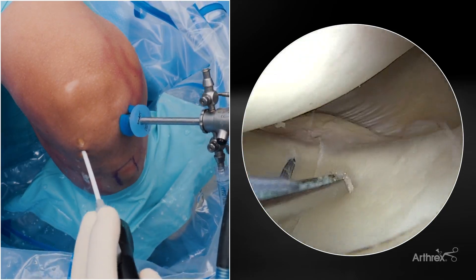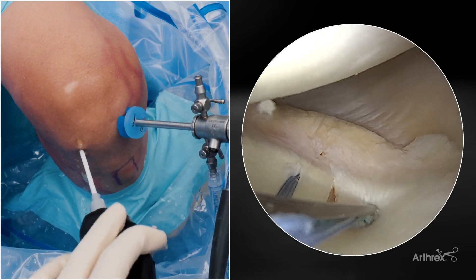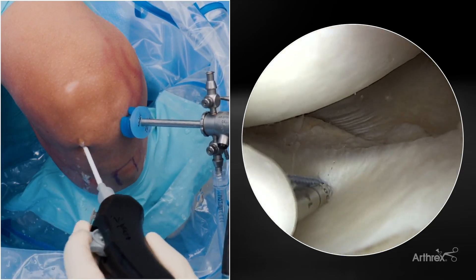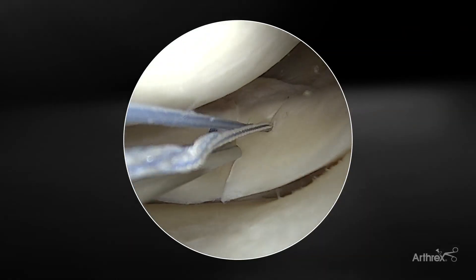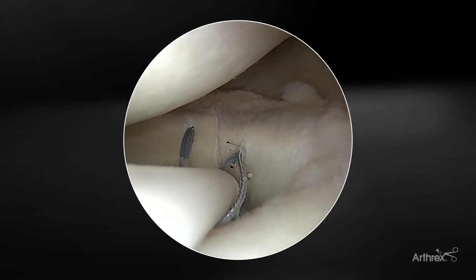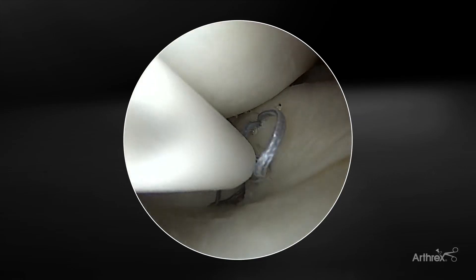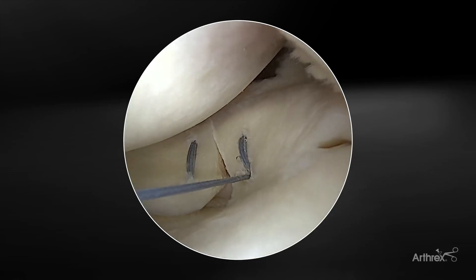We also have to be mindful — as we get close to the midline, we want to be cognizant of the vessels. It is sometimes useful to direct the curvature towards the midline initially, but then I'll turn it away to avoid the midline structures more centrally. Always start peripherally with these, because you'll obliterate your view and it'll be more difficult to work behind the initial suture if you start centrally. And here's our second ripstop suture placed.